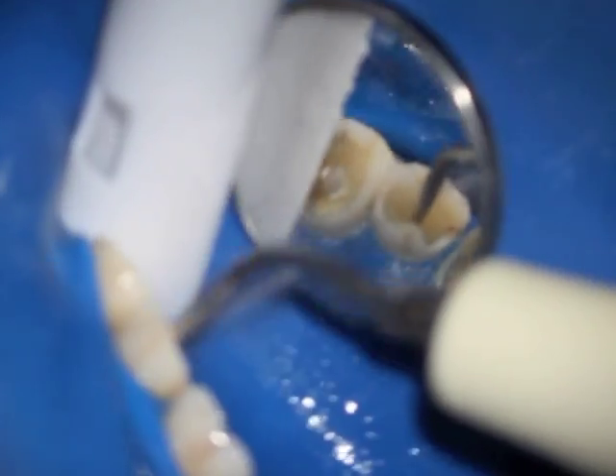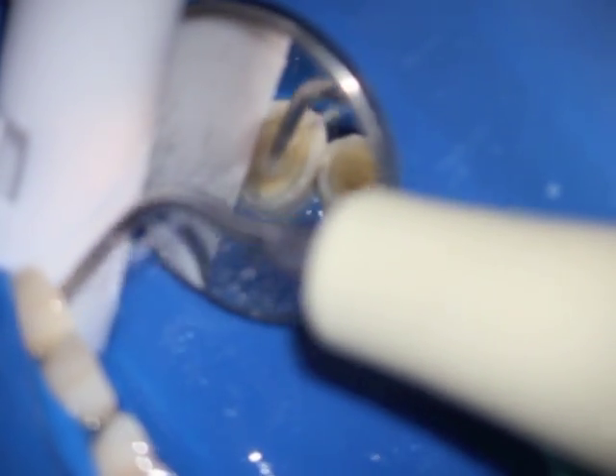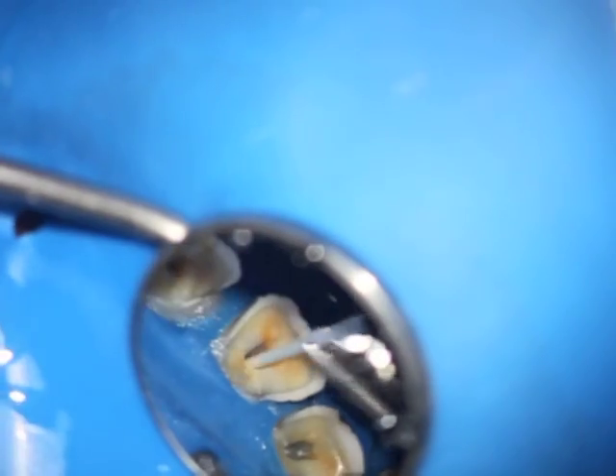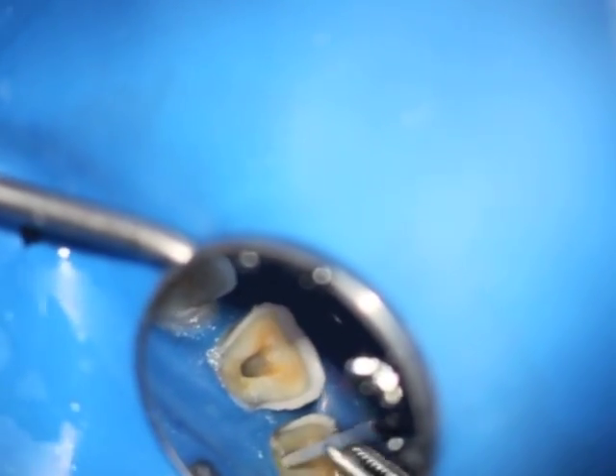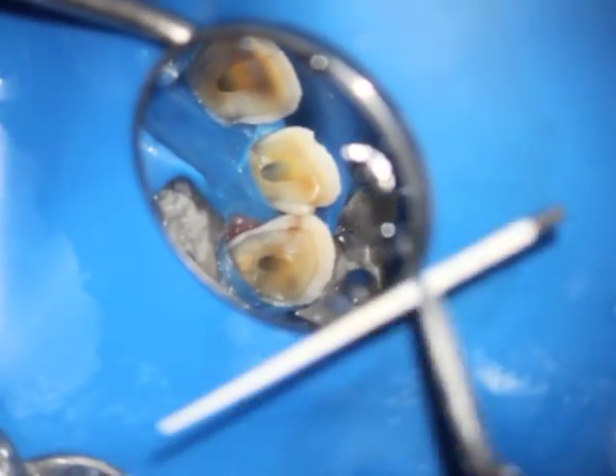I always use an ultrasonic with water — the E14D NSK tip would be a good one to use. It's important to make sure that the ultrasonic tip is not going in deep enough to touch the gutta-percha tip that's in the canal, because if you do that you actually risk removing some of the sealer around the gutta-percha. The water is cleaned off using paper points, and once the space is completely dried off, you are pretty much done.